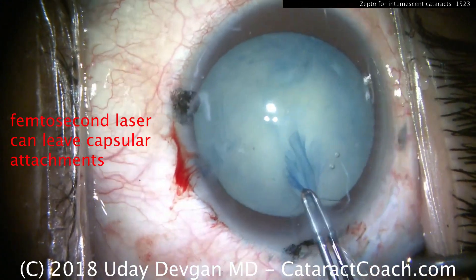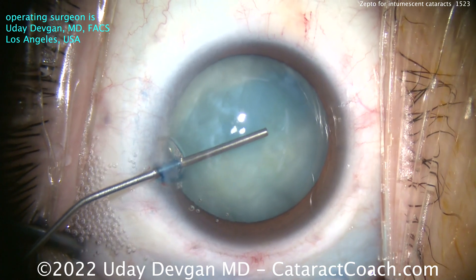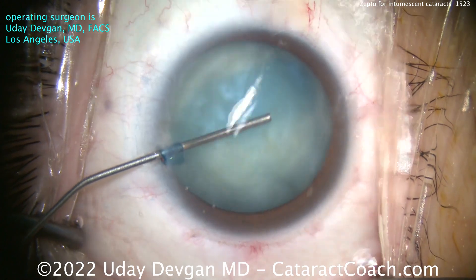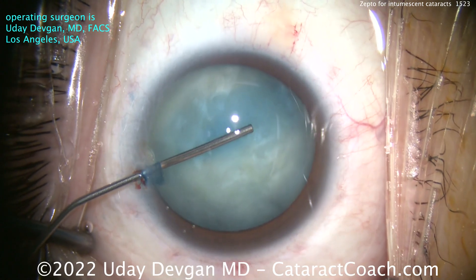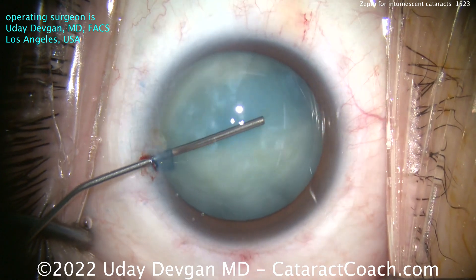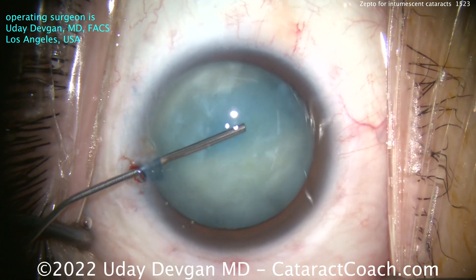So I have a better way for you, and that better way is with this Zepto device from Centricity Vision. I'm a paid consultant at the company. Here's a case with an intumescent white cataract. Look how pressurized the capsular bag is — it's really pressurized. Young patient, about 40 years old, with a high lenticular pressure.